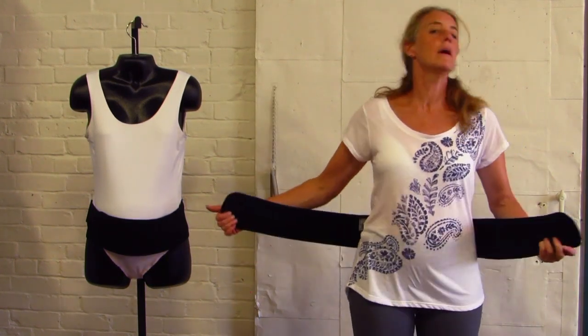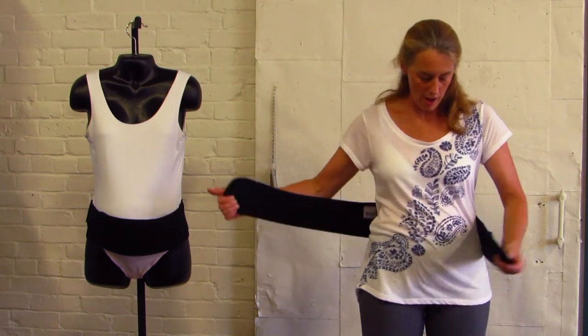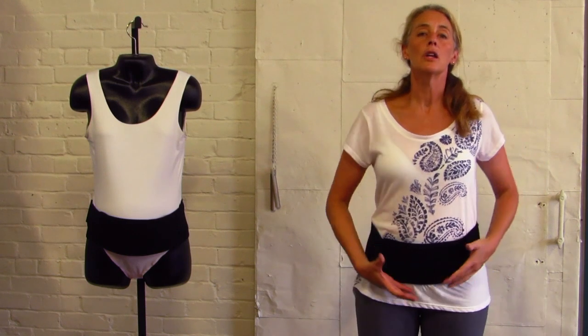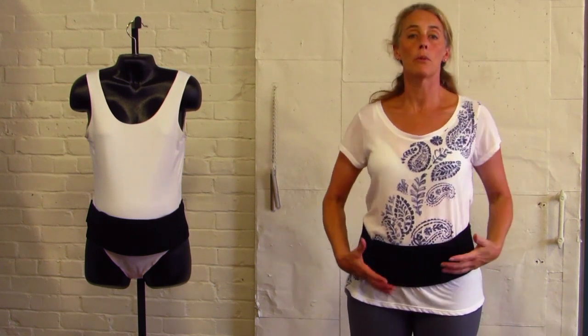So you're going to wrap the Baby Belly Band around your abdomen and put it down on the lower side, so that you can lift the abdomen off of your pelvic floor.